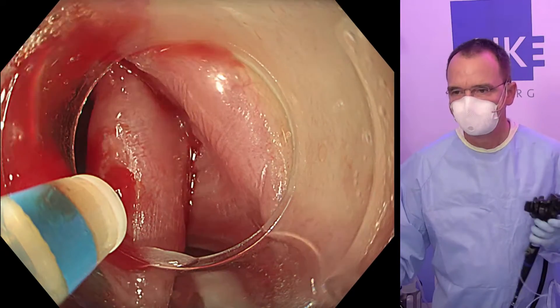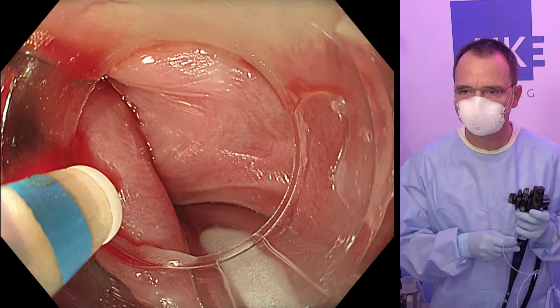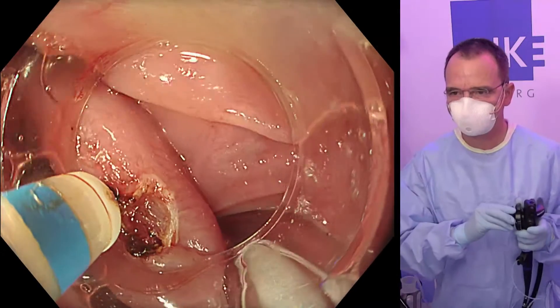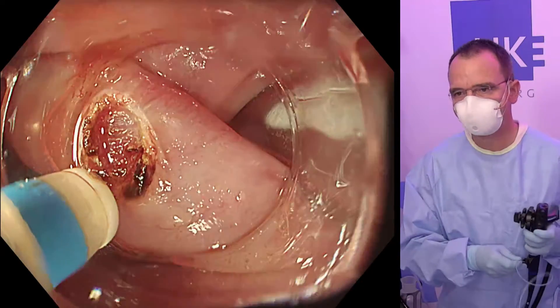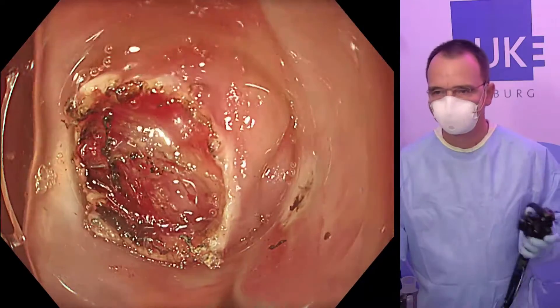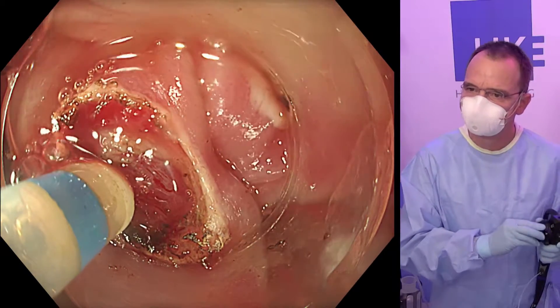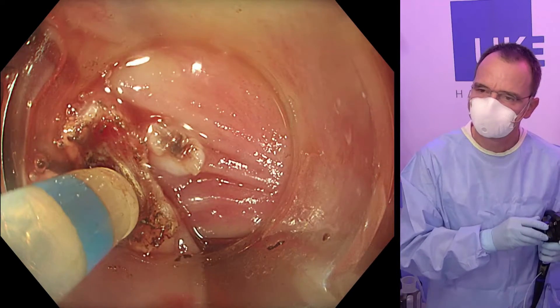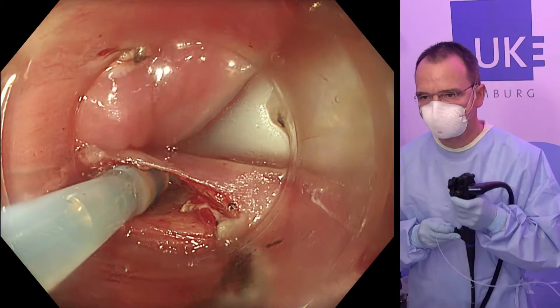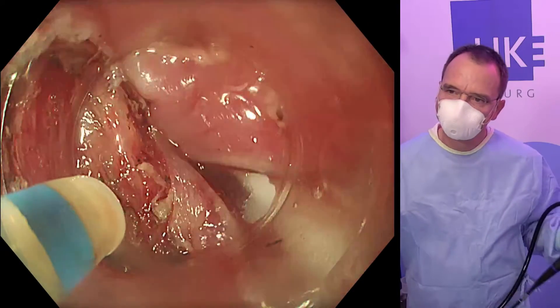A transverse section over the septum is planned, in contrast to a longitudinal incision chosen by some others. So we cautiously start injecting the upper end of the septum and try to make the opening large enough to get into this small tunnel with the endoscope. Careful dissection follows, with injection into the submucosa of the esophageal side.